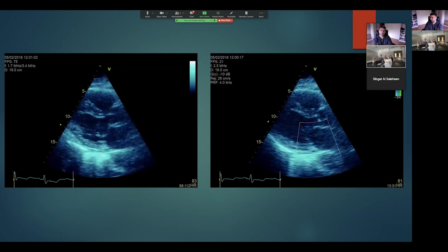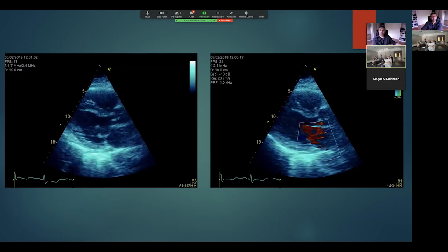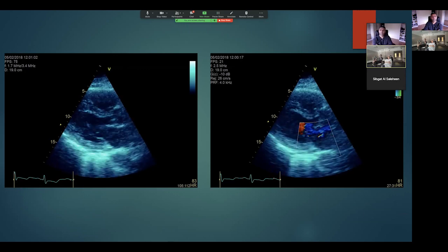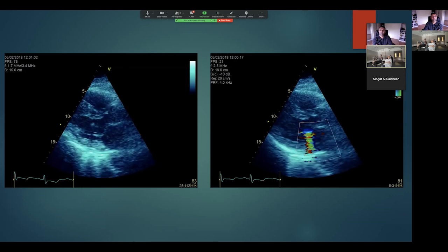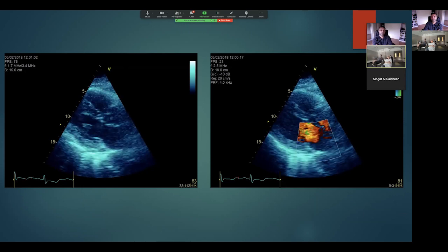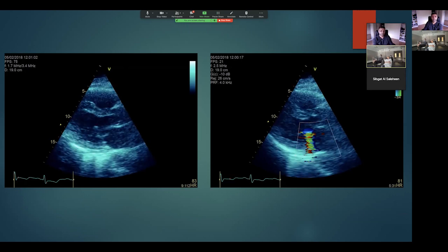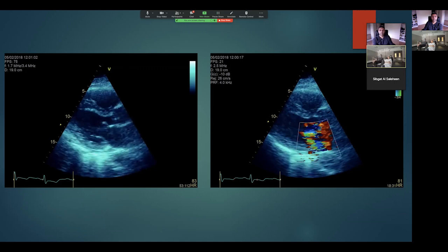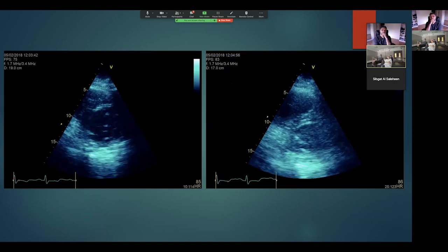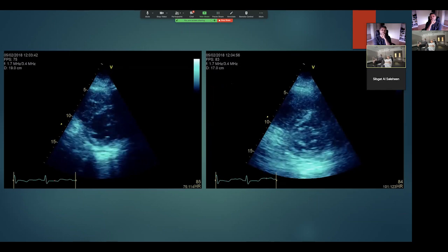Looking at the color Doppler, what I can see in the shot is mitral regurgitation that's posteriorly directed, suggestive of an anterior leaflet pathology, but I need to see further views. So I now like to have a look at a parasternal short axis, panning from the apex up to the base, if possible. So I've got that. Thank you.